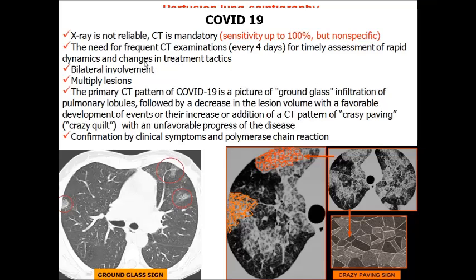The next point is the fact that we need frequent CT examinations, even every 4 days, for timely assessment of rapid dynamics and changes in treatment tactics. Usually, this pathology presents bilateral involvement and multiple lesions in lung tissue.